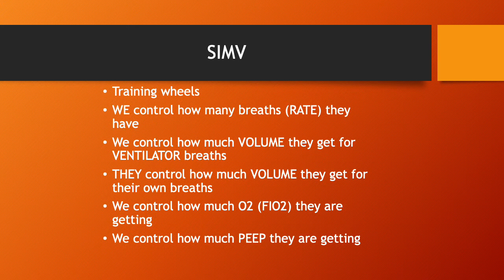However, when you're on SIMV, the patient can also take their own breaths, of course, just like an AC. However, when they take their own breaths, they get to decide what they can do. So I know that's real. Everyone finds this really confusing. So I'm going to show some pictures in the next couple slides, and that will make a lot more sense.